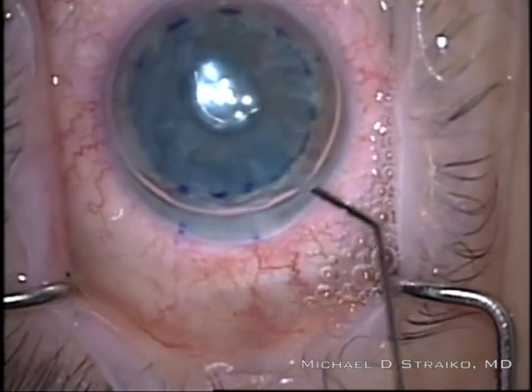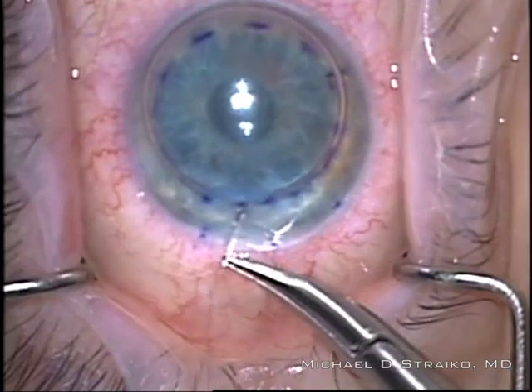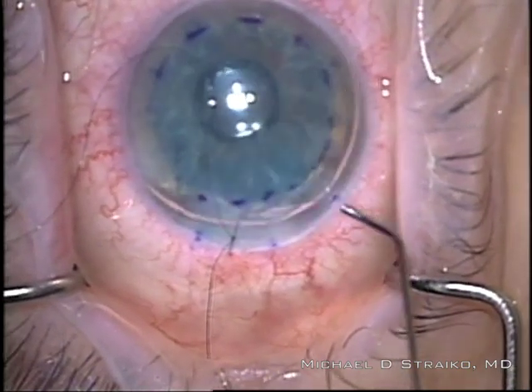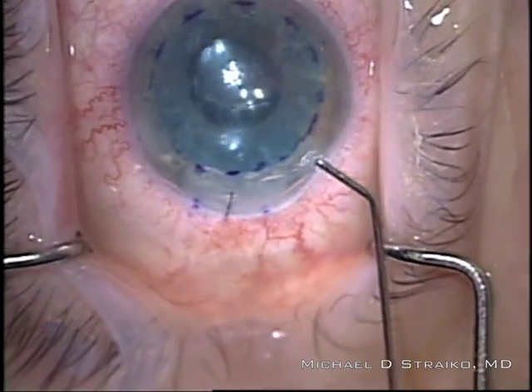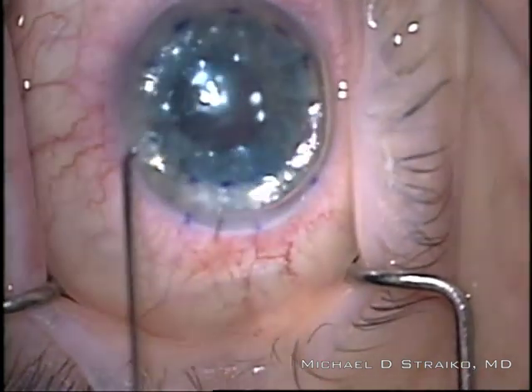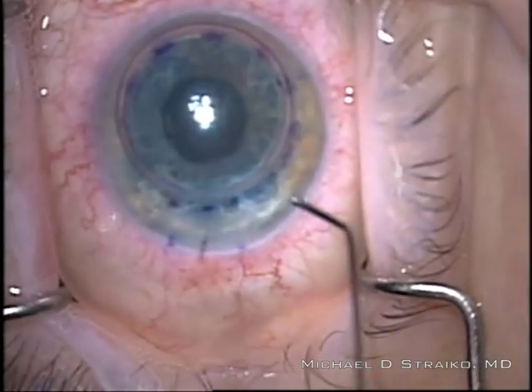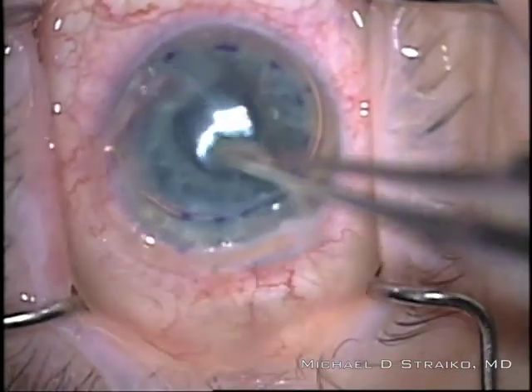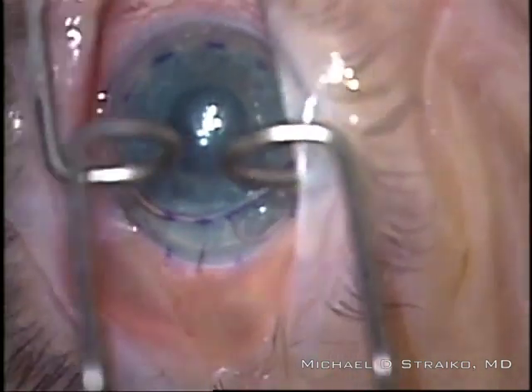Now I'm going to lock it in place with a full fill of 20% SF6. Like before, I do a higher pressure fill for 2 minutes and then a physiologic pressure fill for 8 minutes. I still suture my incision closed even if I didn't have to earlier — I think it's a good idea to suture the incision as soon as possible. Now I'm going to adjust the size of the gas bubble after my 10-minute time out, and I feel certain there's no gas behind the iris. I refill a little more and leave behind about an 80% gas bubble, then put on the collagen shield soaked in antibiotics and steroid — and that's the end of her case.